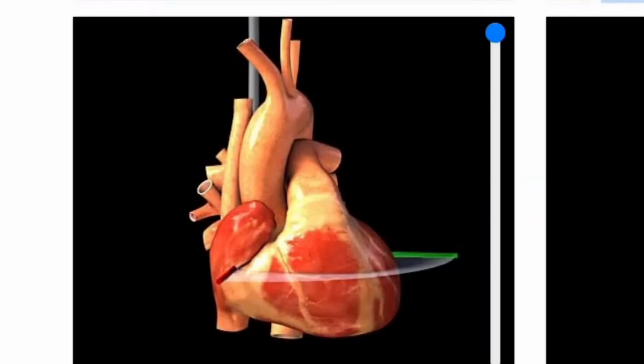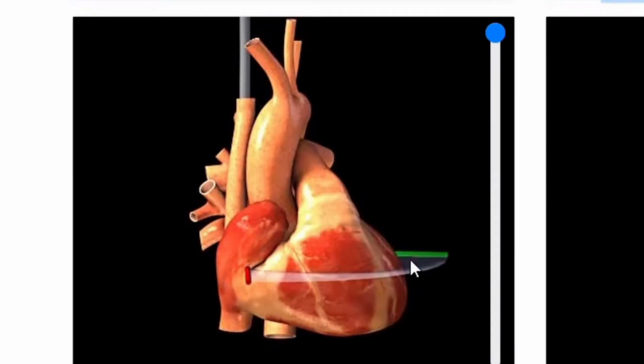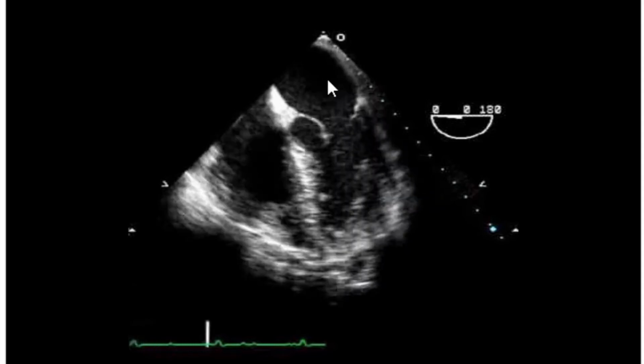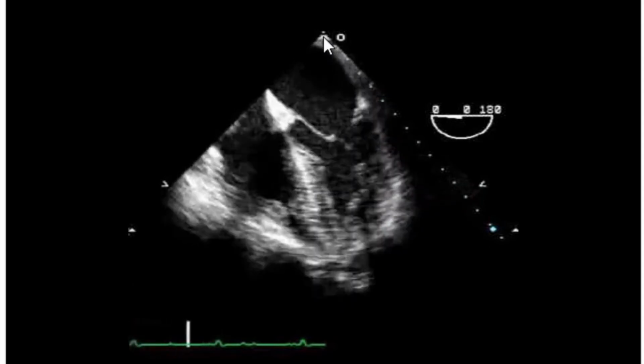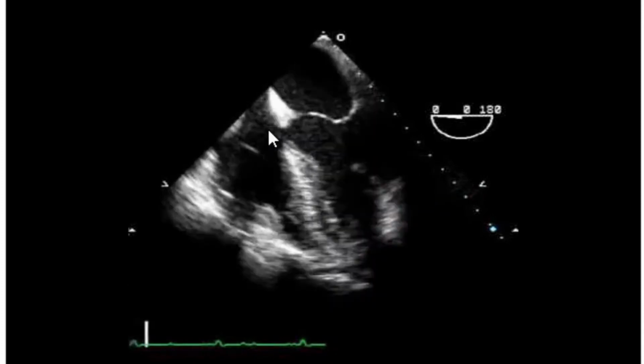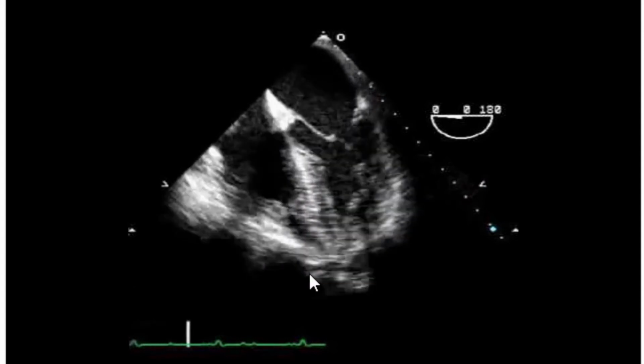This is a very easy view, and you can see that the heart's being imaged from behind the left atrium, and this is the beam plane of the ultrasound. And this is the view that we get. We can see all 4 chambers here. The left atrium closest to the probe, the mitral valve, the left ventricle there, the right atrium, tricuspid valve, and right ventricle.